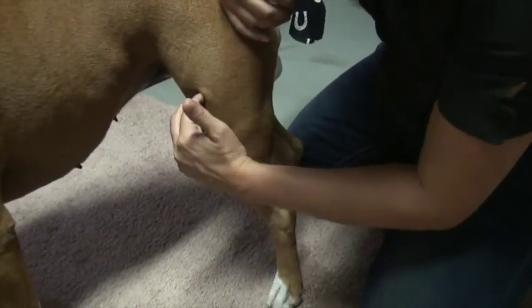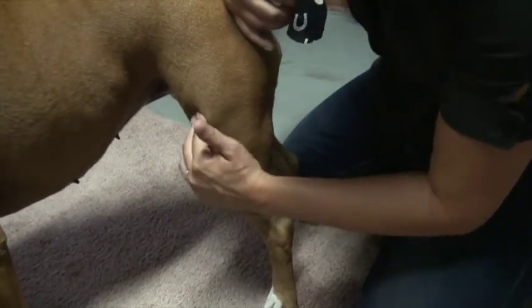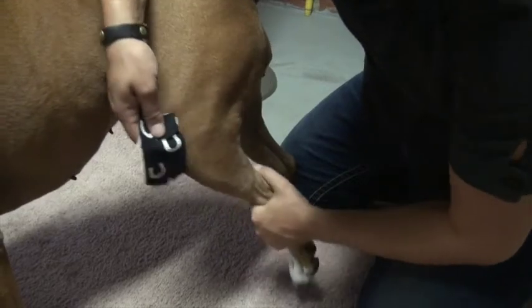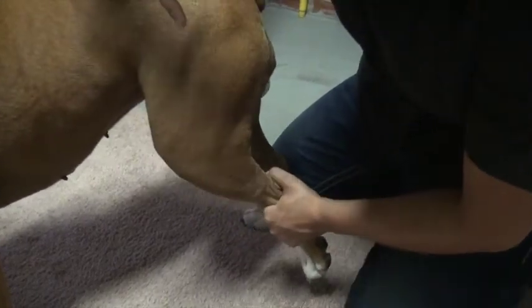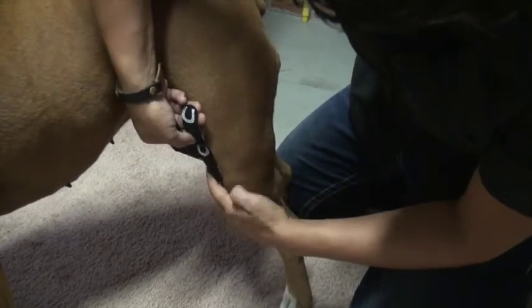So now, the knee of the dog, a lot of people think it's down here. This is actually the ankle joint. The knee is up a little bit higher, so if we bend her leg, we can actually see where that knee joint is, so we know where we're going. So I'm going to place this basically right over that knee joint.